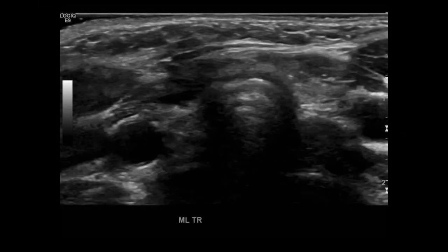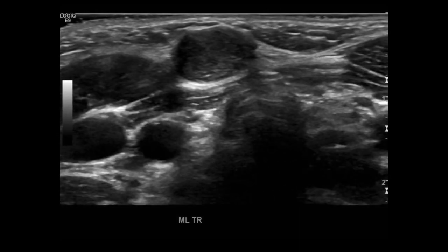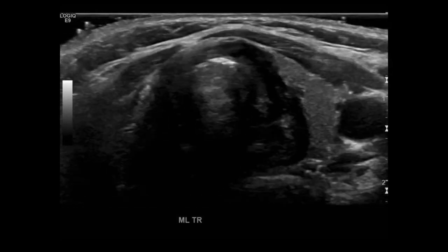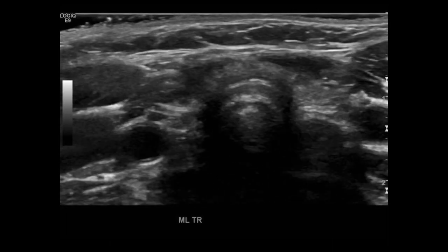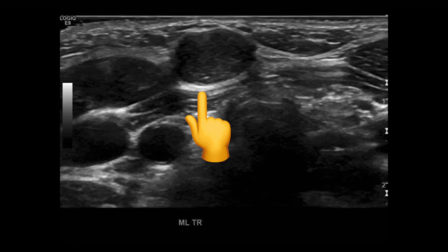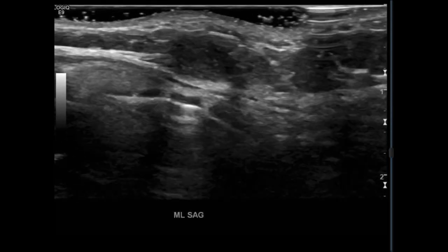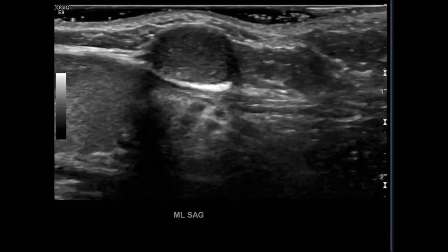Here's a transverse view of the neck at level five. Beginning in the thyroid and angling up, you can see the thyroid there. In front of the thyroid you can see the strap muscles, and then angling superiorly, that circular structure is a thyroglossal duct cyst — it is just right of midline. These cysts tend to fill up with mucus material, so you can see this one is not anechoic; it has internal debris and internal echoes, but all the tissues around it appear normal, so this one is not infected. Here's the cyst in sagittal — you can see it's just slightly inferior to the thyroid cartilage.